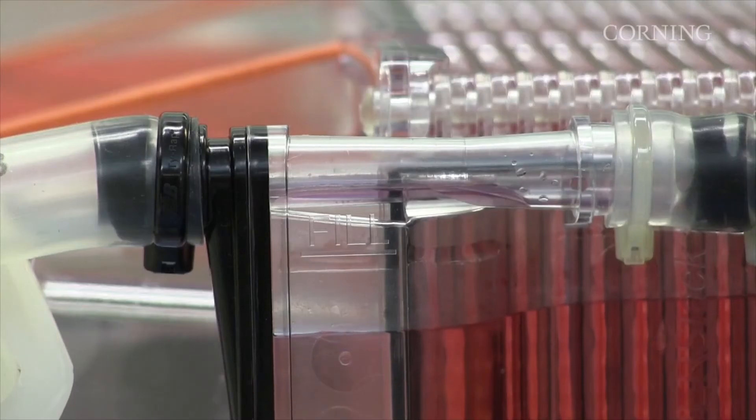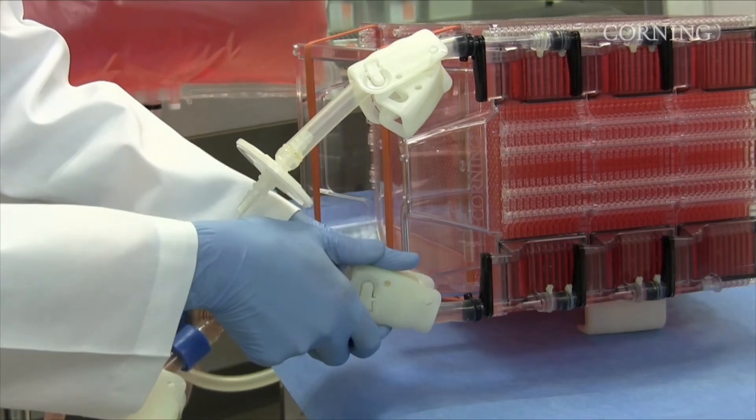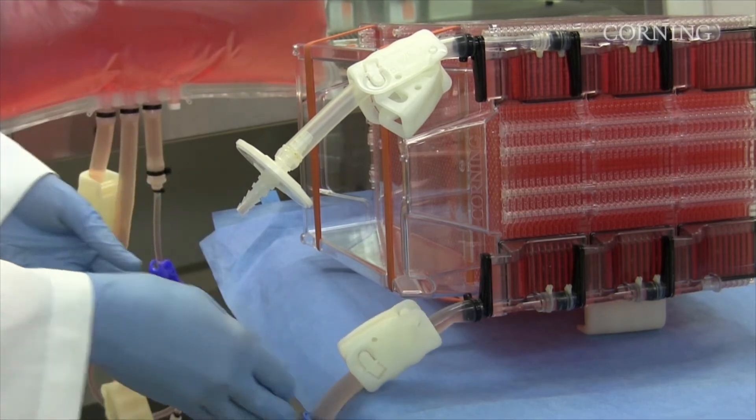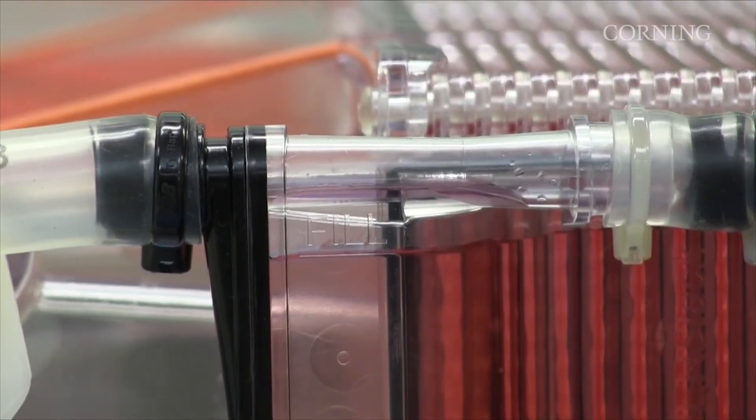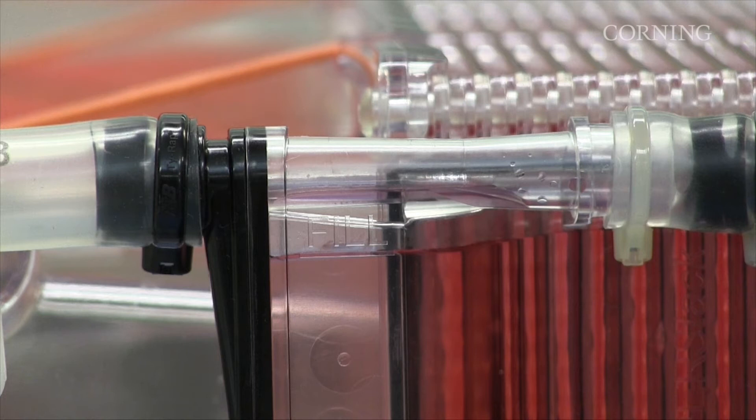When liquid approaches the fill mark on the air manifold, close the liquid handling tubing clamp to stop flow into the HyperStack vessel. You may notice liquid levels continue to rise slightly even with the fill line clamp closed. This is normal and expected. If the HyperStack vessel is filled until it is visibly full, the vessel will overflow and pressurize, which increases the risk of vessel failure.